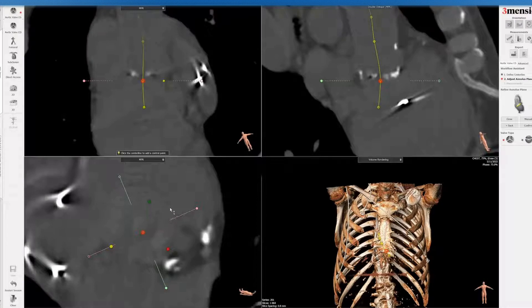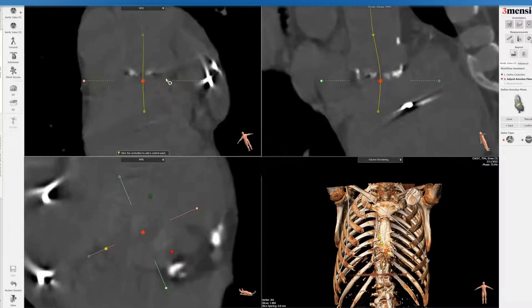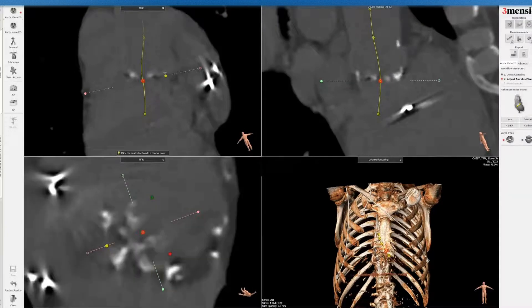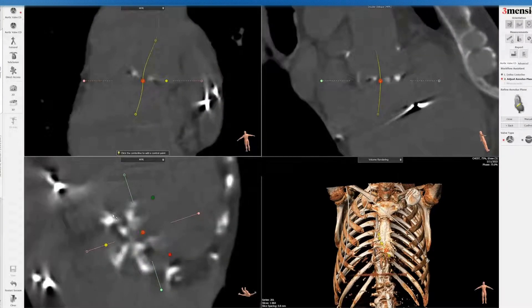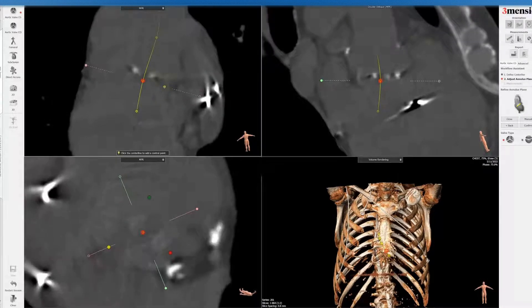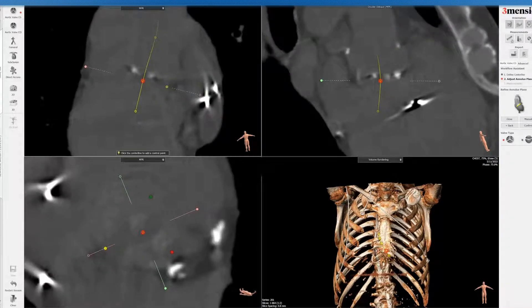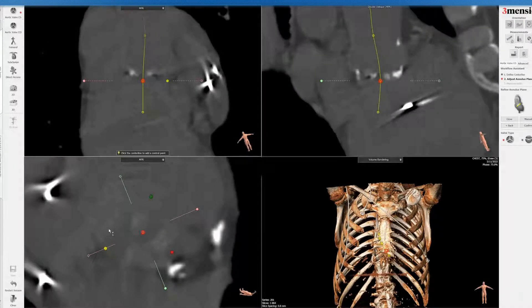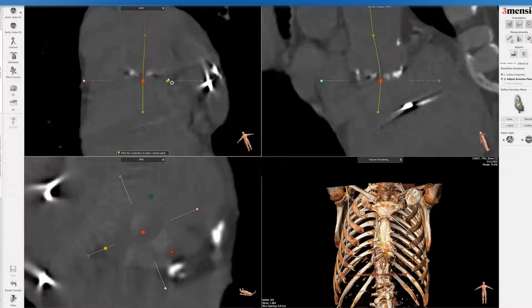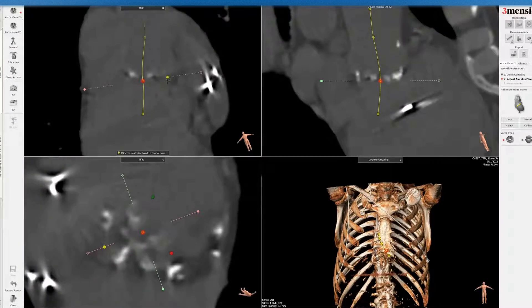I'm going to straighten out the centerline here. Now what I do is to try to fine-tune this — this is where the challenging aspect comes in. You can see this is the sinus with the leaflet, so you have to drop it down until the sinuses disappear. Sometimes you can see it better if the anatomy is such that the calcification extends all the way to the base of the cusp, so you can actually see where it rises. But if not, it can be a challenging estimation.